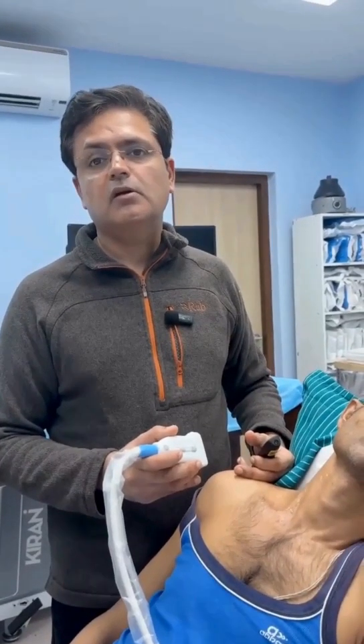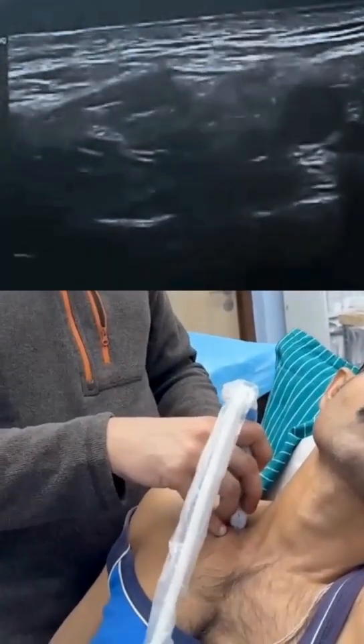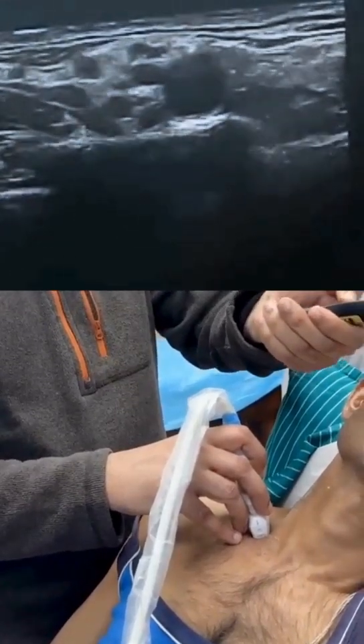We're going to be doing a suprascapular nerve block from the anterior approach today. We start from the supraclavicular region. You can see the brachial plexus on the lateral side.